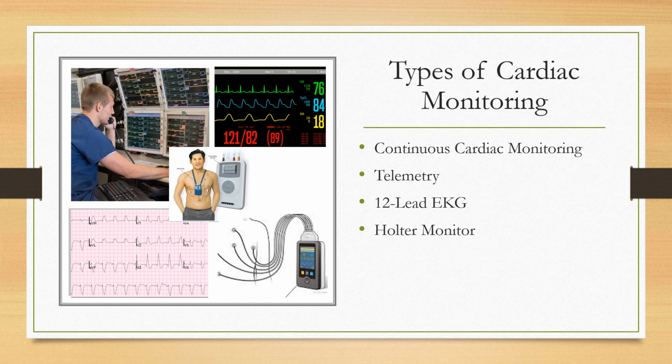Well, we can set them up with a Holter monitor to go home with, and they do their regular activity for the 24 or 48 hours, they go about their regular day. They return the device, and the computer will give us a readout of every beat, and whether there were episodes of dysrhythmias, whether there were extra beats, missed beats, fast rates, slow rates, all that information. So it's very useful for arrhythmias.